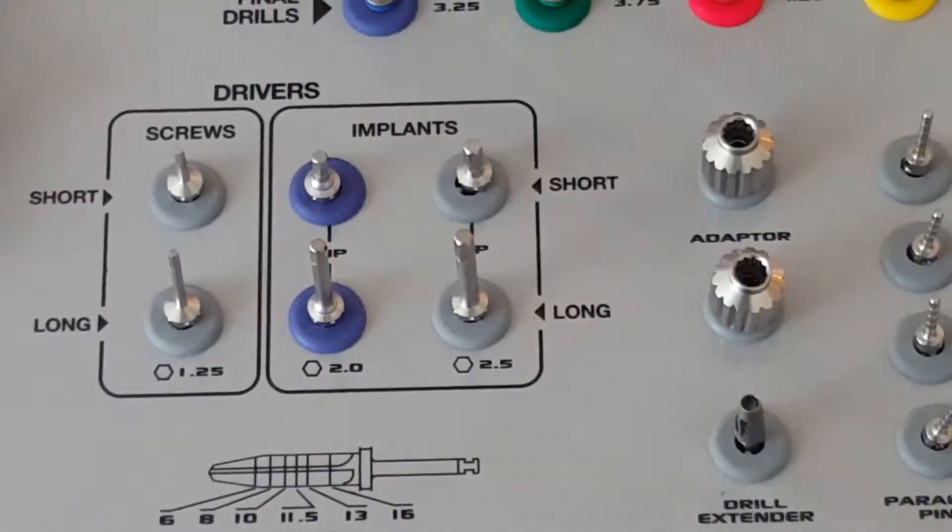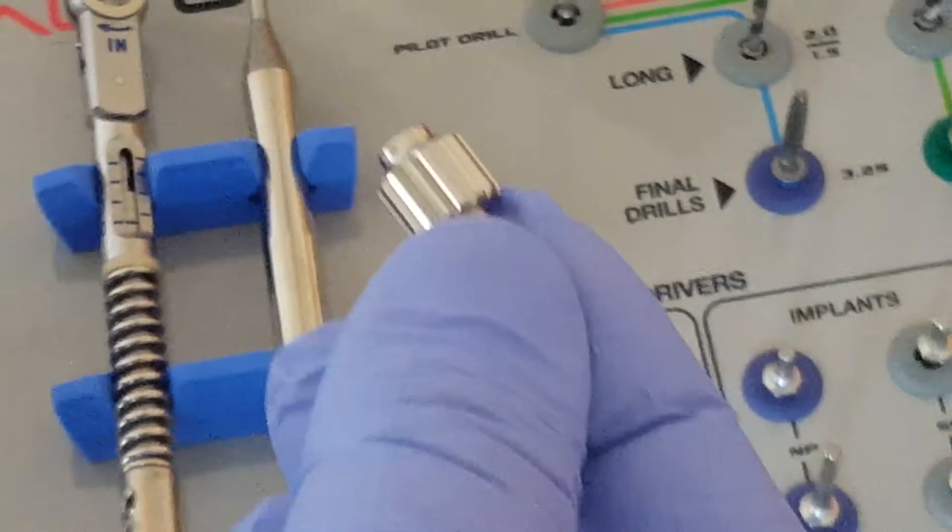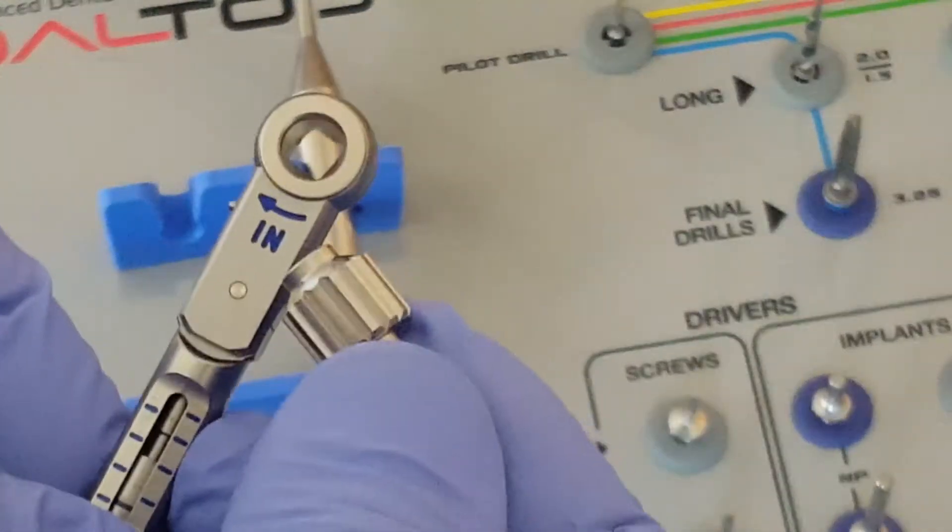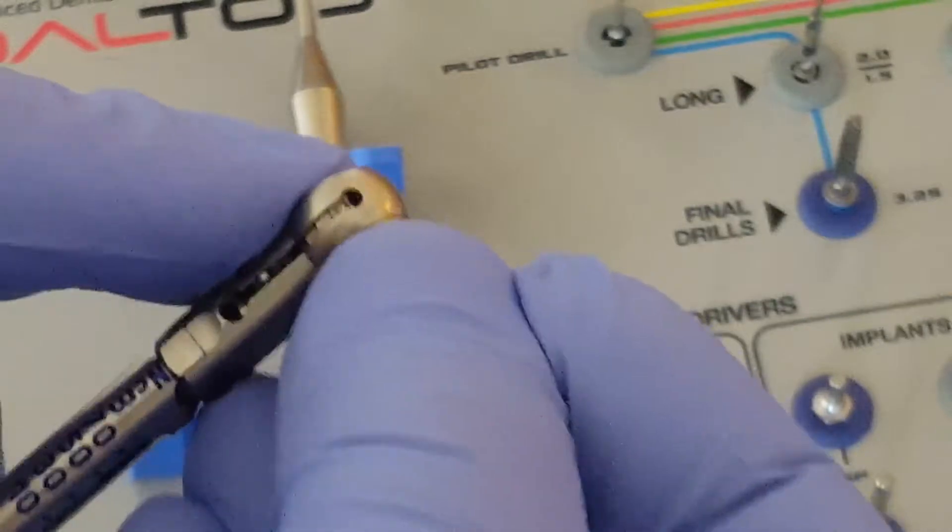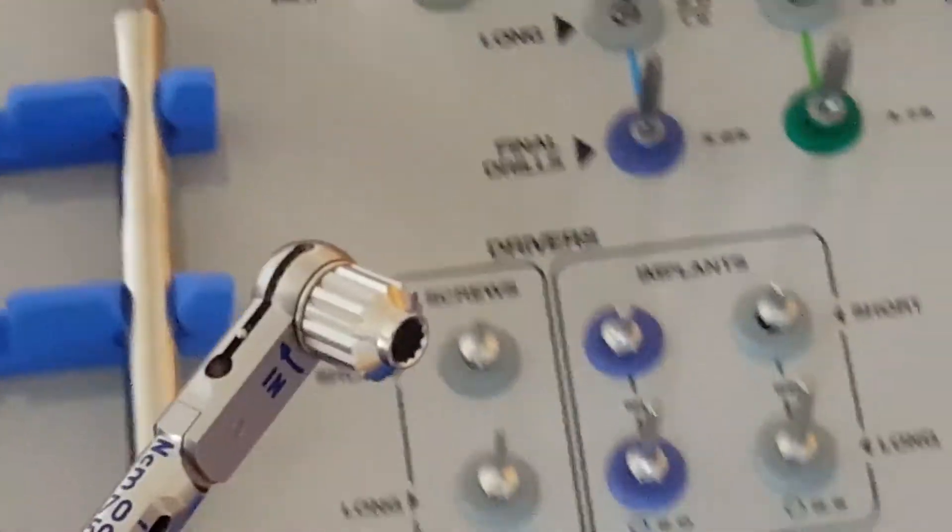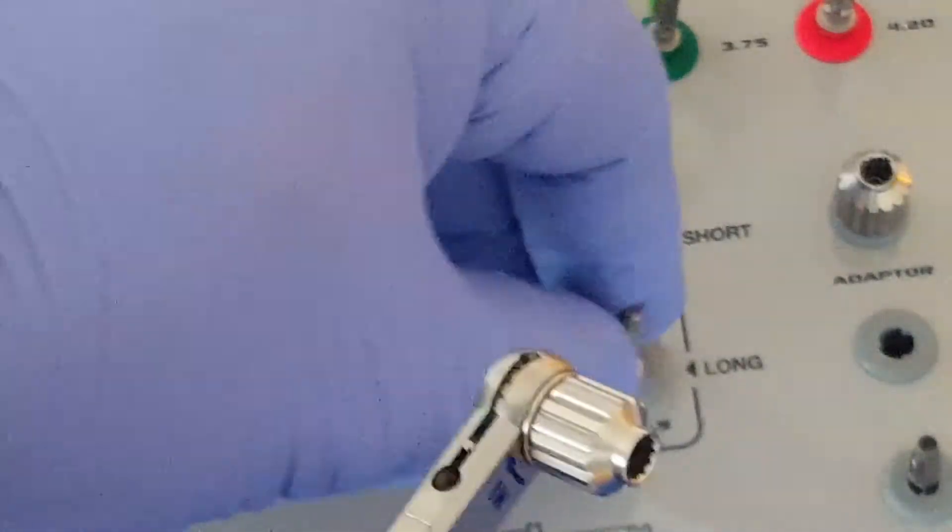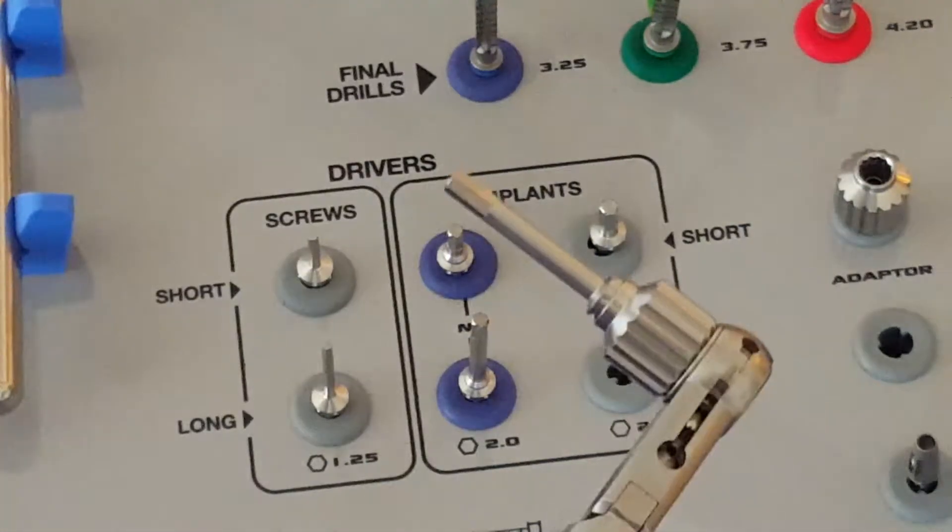If the ratchet is going to be utilized to seat the implant, then the adapter is taken. We take the ratchet. We see one side says in, one side says out. We insert the adapter into the side that says in, and then we pick and select the appropriate implant insertion key. If it's a standard platform, we would take the long or the short and insert that to complete the assembly.